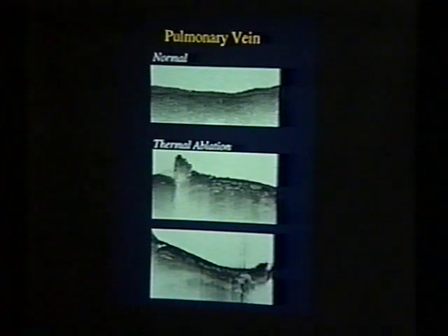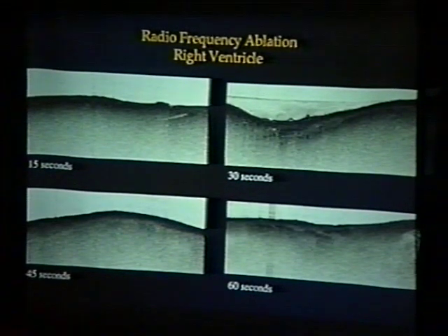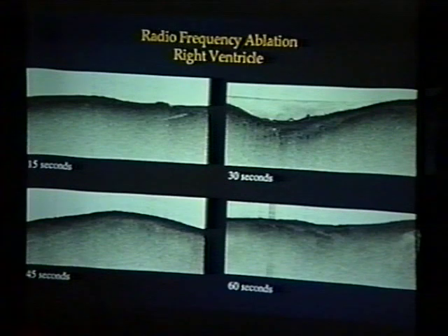Now, why that's important for us in guiding this RF ablation is, you see that the first thing that changes as RF ablation begins is the loss of this polarization sensitivity. I assume that this is due to myosin and elastin, though collagen is a possibility. And in cartilage, collagen is the main cause, which is where the focus of our work is in this area. Now, after you've lost the polarization-sensitive areas, you then see an increase in backscattering intensity until the tissue pops. So this suggests you'll be able to guide this procedure.